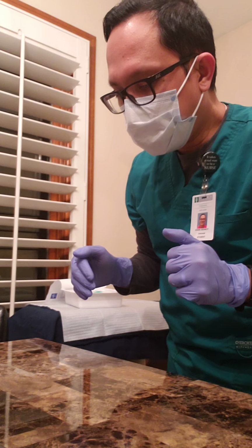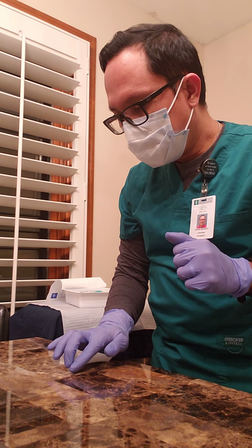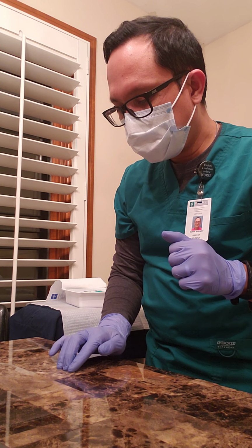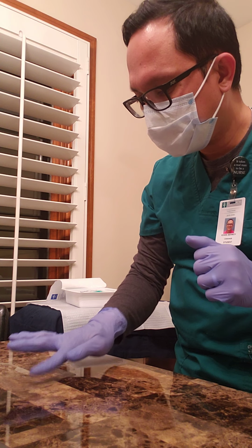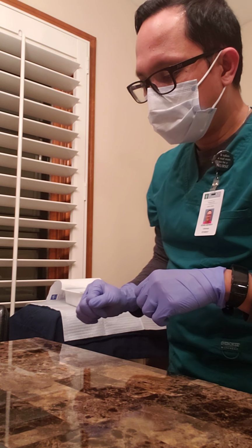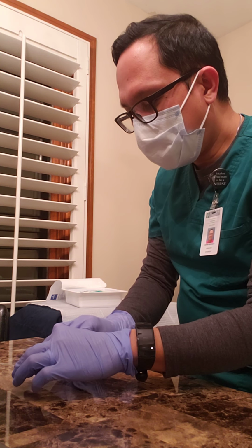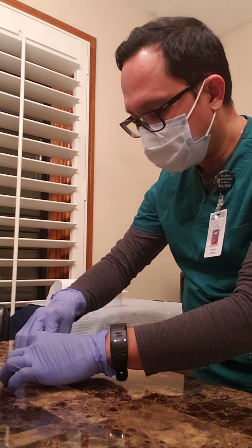Before I take the old dressing out, I want to make sure I inspect the insertion site, checking for any tenderness, swelling, or redness. If there is none, then I'm going to go ahead and take the dressing out. Since it's a transparent dressing, I'm just going to take it out by pulling it outwards.